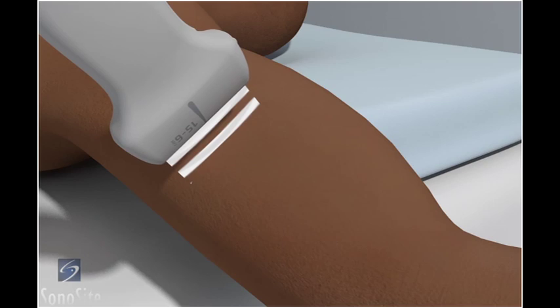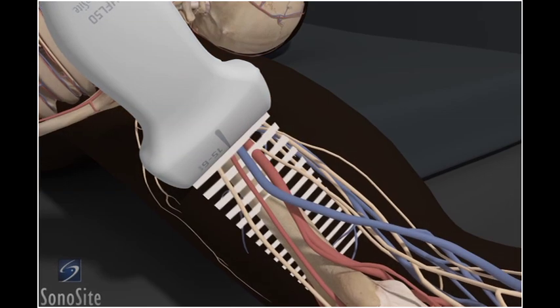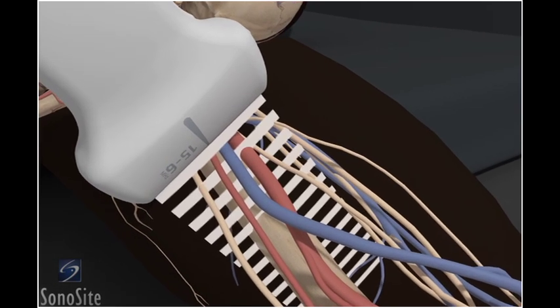The transducer is placed transversely just proximal to the medial condyle in the bicipital groove, with the orientation marker directed to the patient's right.